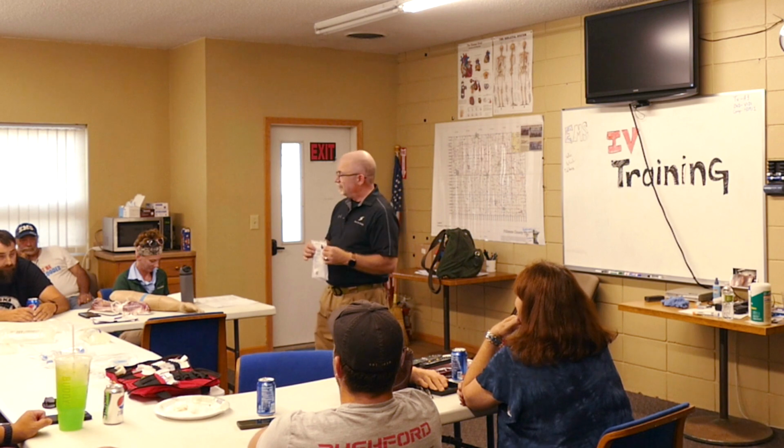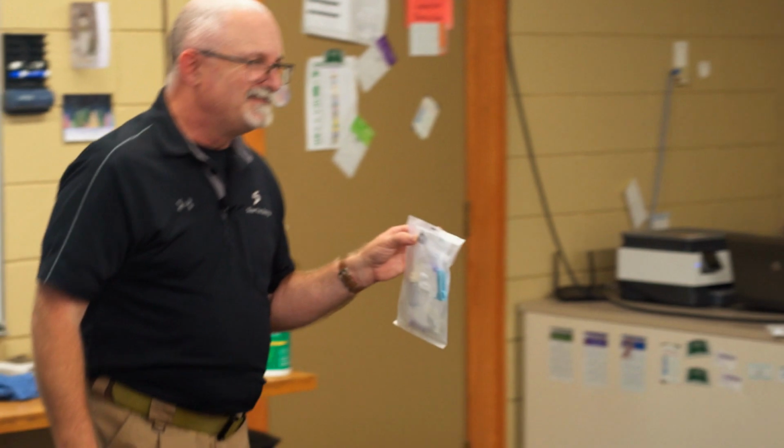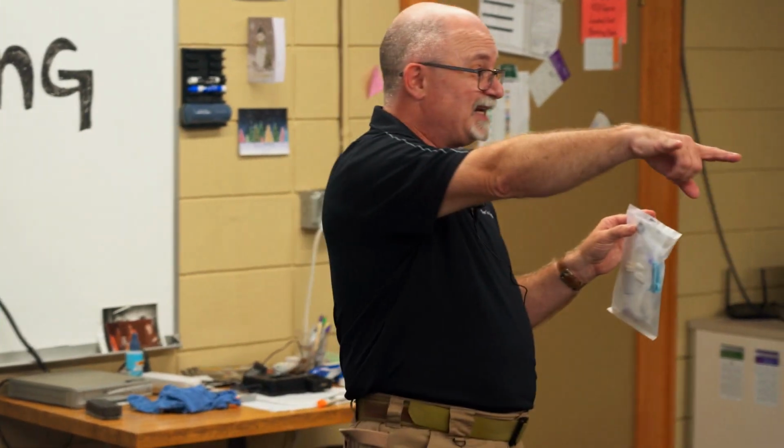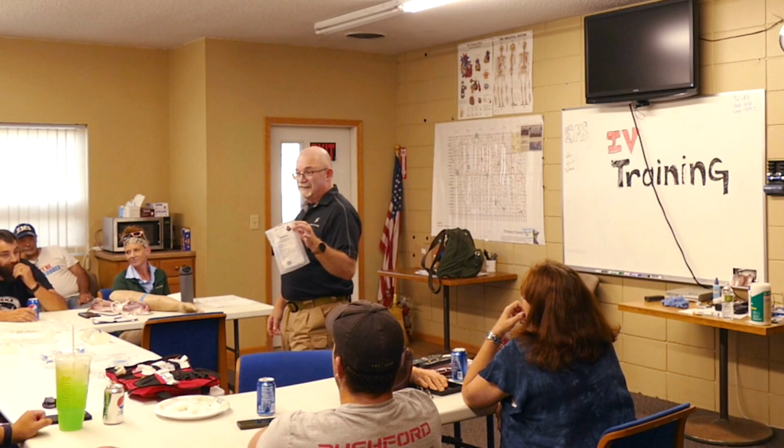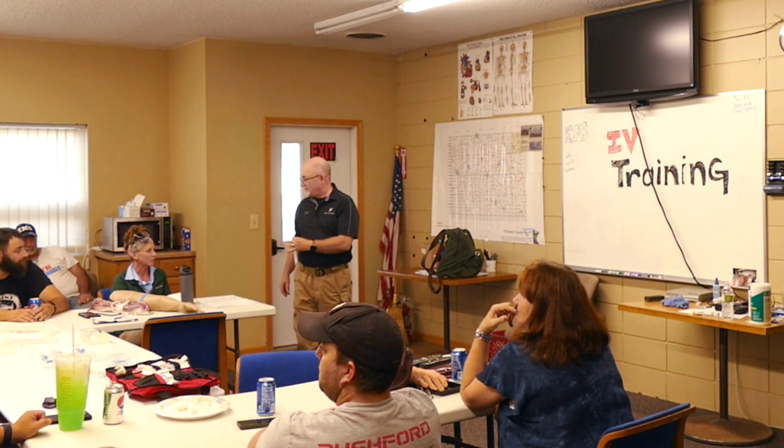Now, the video did talk about drip sets, did it not? You already stole my thunder. So the number 10: is this a macro or a micro drip? It is a macro drip. So what does the 10 stand for? Anybody besides this group back here that knows everything? What's the 10? It's 10 drops per milliliter. It's not necessarily the rate, but the volume it takes to make one milliliter. So 10 drops equals 1 milliliter.